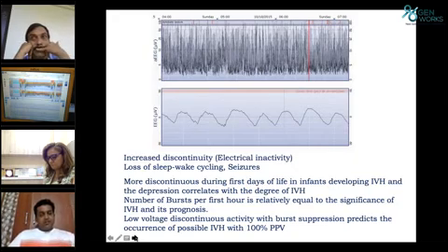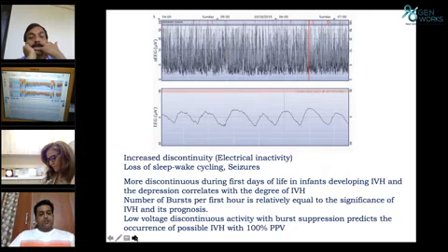Mind you, here we need to understand what the normal pattern is at 26 weeks, because in neonates we tend to have increased discontinuity, loss of the sleep-wake cycle, and artifact-like pictures that we tend to think of as seizure. Moreover, we have to have a lot of suspicion to suspect intraventricular hemorrhage, thereby understanding the discontinuous pattern.